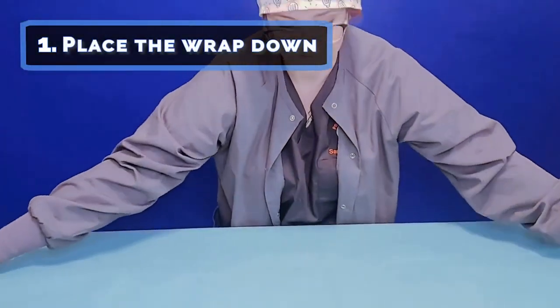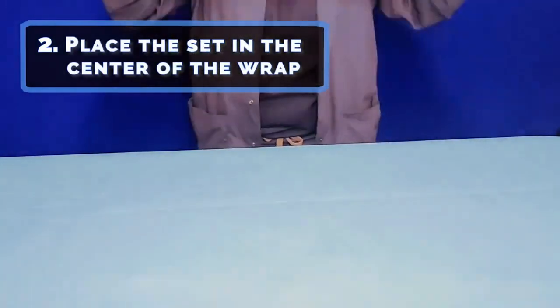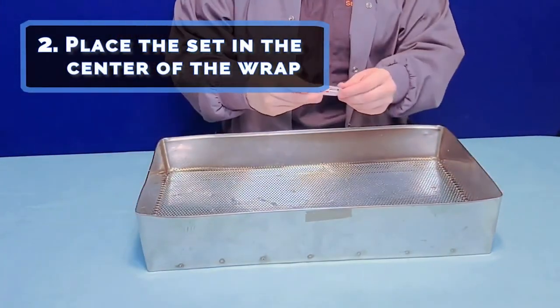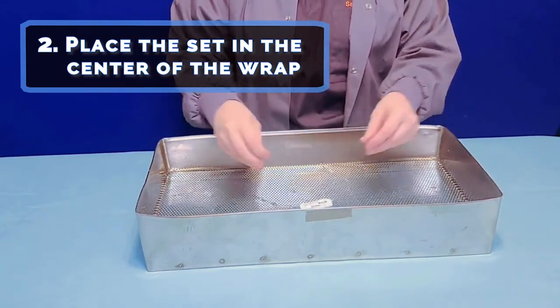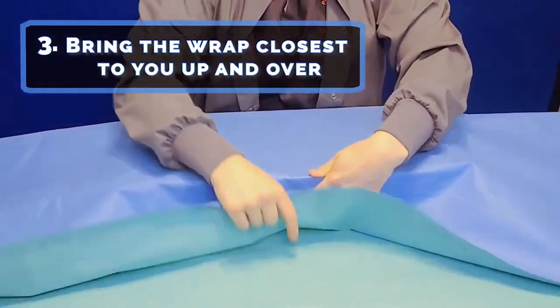Position the wrap so that it looks like a square, then place the set in the center of the wrap. Check with your facility to determine if corner protectors are needed. Step three: bring the wrap closest to you up and over, completely covering the side of the set, and make a tab. This is crucial for aseptic technique.